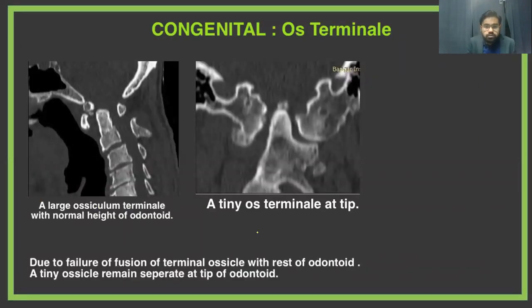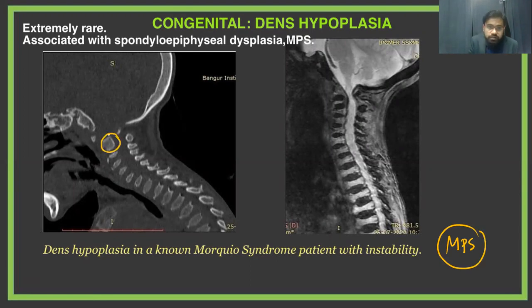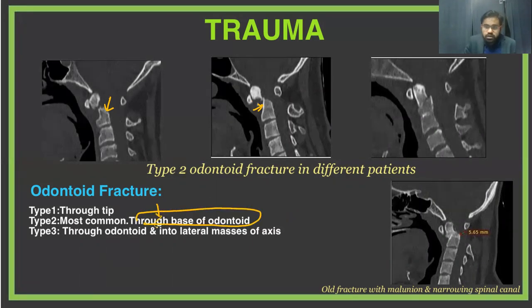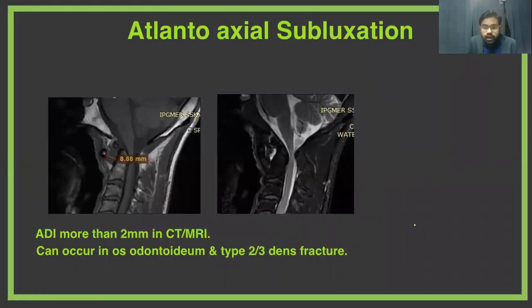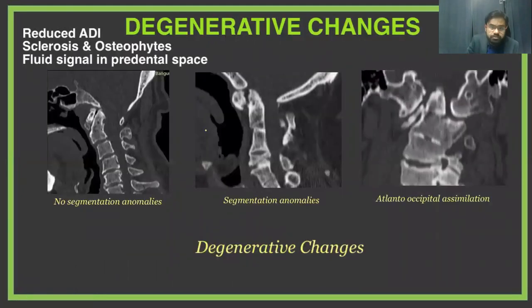This is os terminale, which is due to failure of fusion between the terminal ossicle and the rest of the odontoid. This is a congenital case of mucopolysaccharidosis, where the dens is severely hypoplastic; note also the wedging of the vertebrae. This is a trauma patient with injury to the dens — type 2 dens fracture at the base of the odontoid was the most common in our study. Coming to atlanto-axial subluxation, an ADI interval greater than 2 mm on CT is an indicator of atlanto-dental subluxation. This shows degenerative changes with a reduced atlanto-dental interval, sclerosis, and osteophytes.